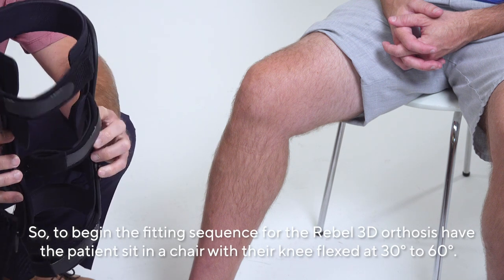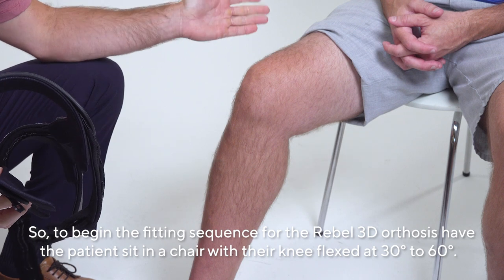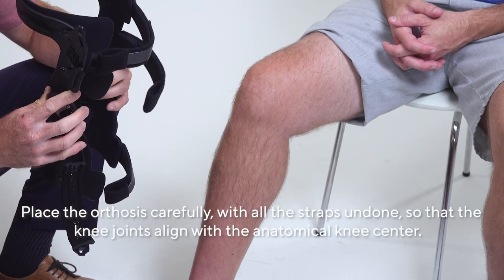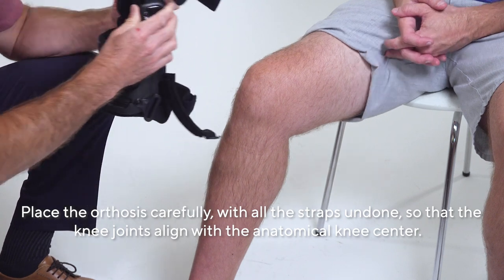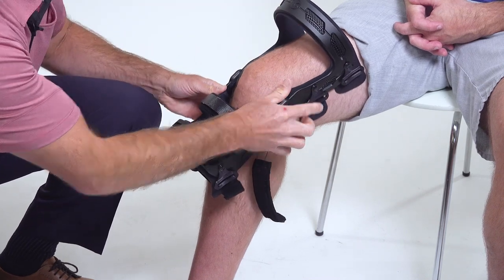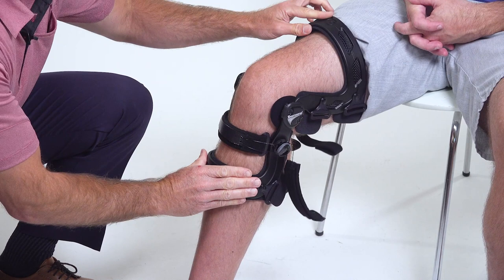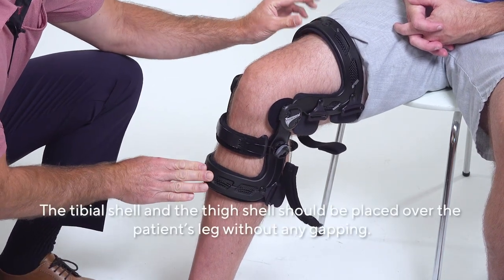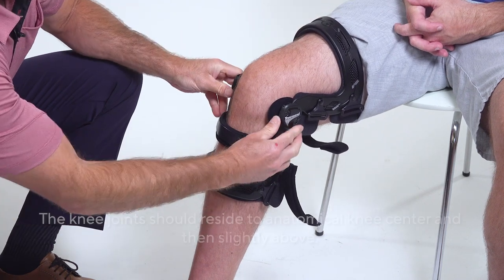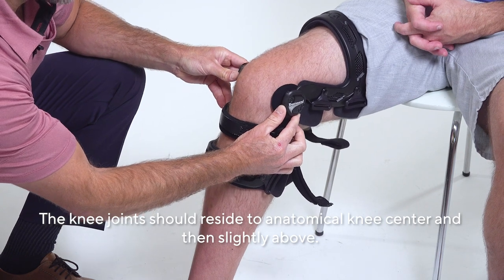To begin the fitting sequence for the Rebel 3D Orthosis, have the patient sit in a chair with their knee flexed at 30 to 60 degrees. Place the orthosis carefully with all the straps undone so that the knee joints align with the anatomical knee center. The tibial shell and thigh shell should be placed over the patient's leg without any gapping. The knee joints should reside at the anatomical knee center and then slightly above.